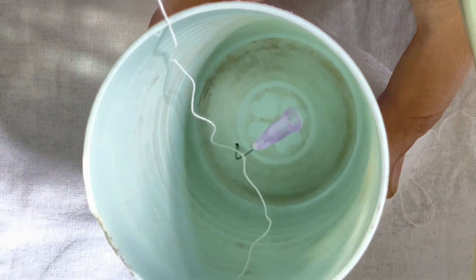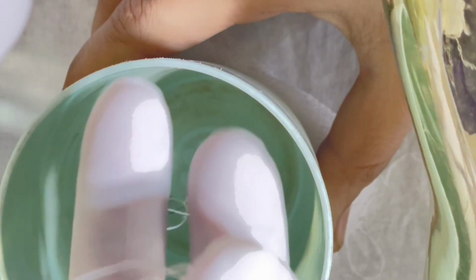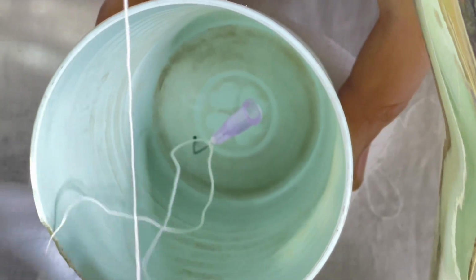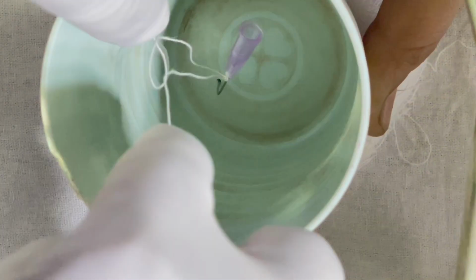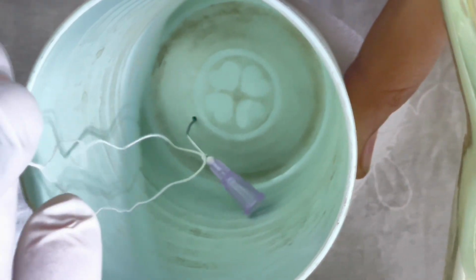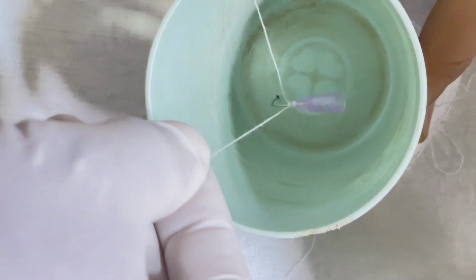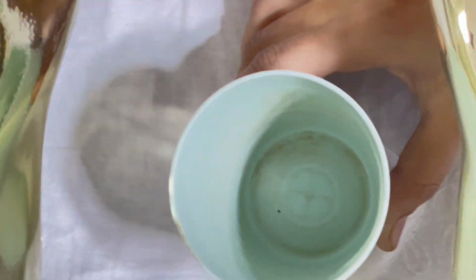So this is the way to demonstrate suturing. So this is suturing around the hook. While suturing, if I give much traction, the hook will come out. So this is the way to demonstrate the suturing around the hook.